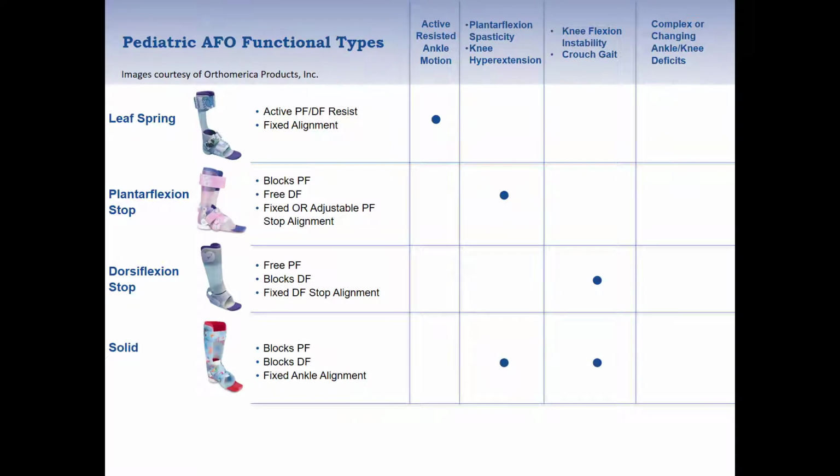The solid AFO is the combination of plantar flexion and dorsiflexion stop types. These orthoses have fixed ankle alignment. Solid AFOs are typically used for static positioning to maintain range of motion, or to provide support for the ankle and knee when combined with tuned shoe rocker modifications.